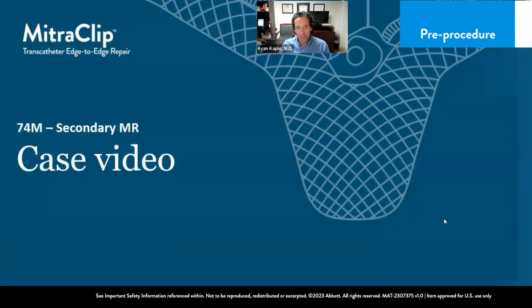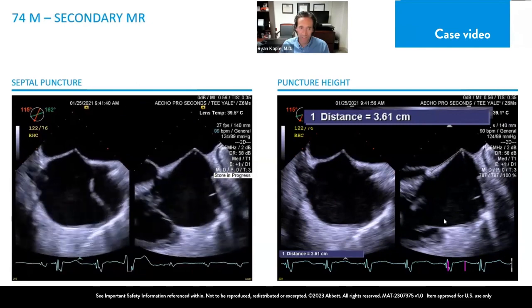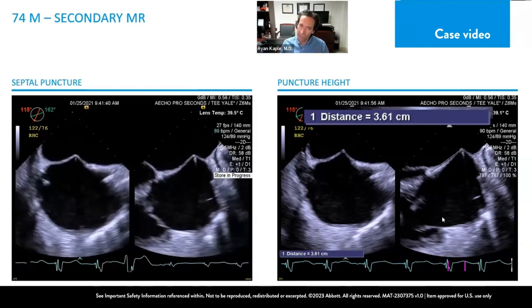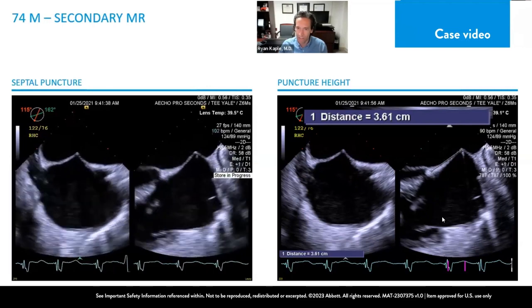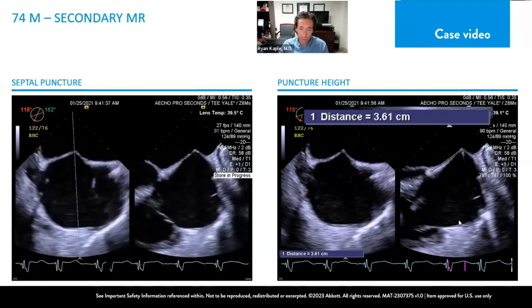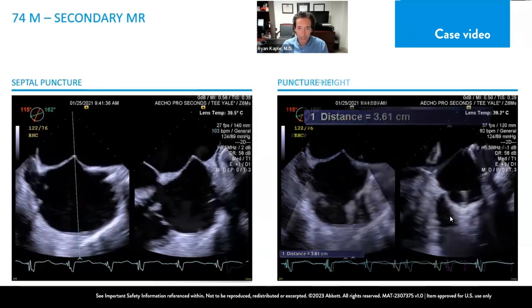And so this is a little bit different transseptal. We don't have that thickening of the superior part coming down into the fossa, but we were able to get posterior enough. A good sized tent there, enough that it feels secure, but not so much that I feel like we're going to dive to the back wall. Good height, again, giving ourselves some latitude, knowing the tent height is about 1 centimeter. So we accepted this 3.6 as a good height.